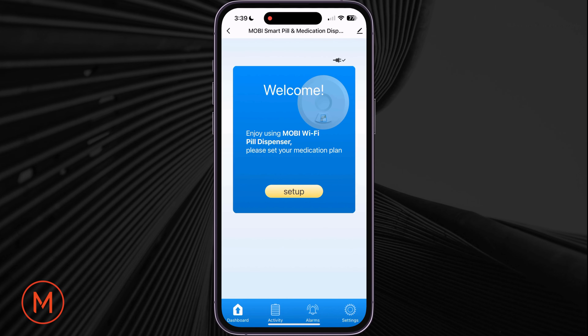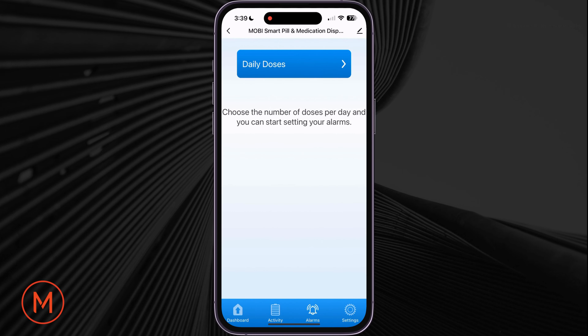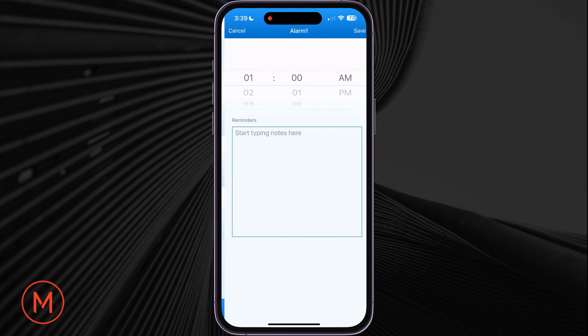On the main screen of the pill dispenser, tap on Setup, then tap on Daily Doses. Here, you will enter the number of doses that are taken on a daily basis. Once the number of doses has been selected, you will now set the alarms. Select each alarm to specify the desired time the alarm should go off and ready the pill dispenser to dispense your medication.